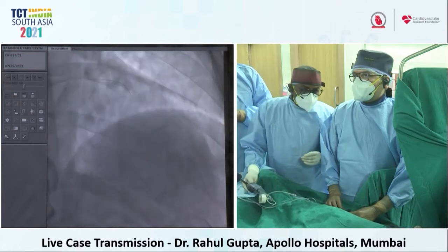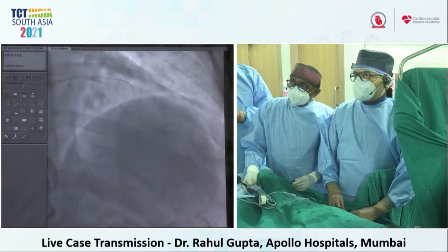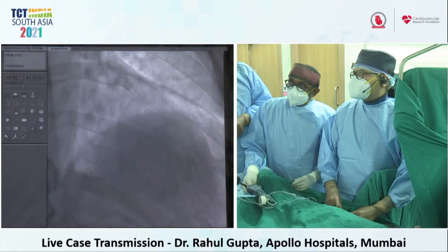I think, Sanjay sir, as you understand, when you're putting a bigger size catheter, obviously we need to be more careful, and there could be more chance of occlusion, as you said. We need to have larger data.